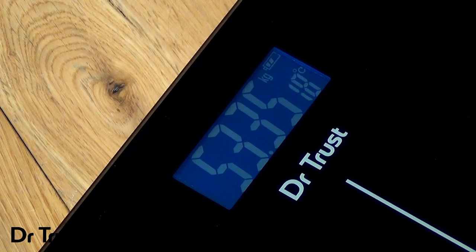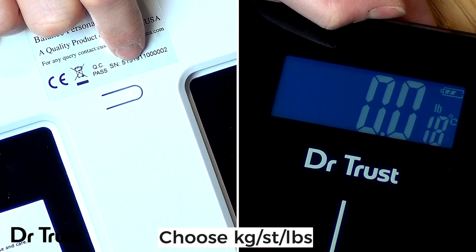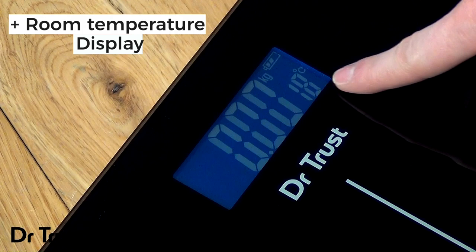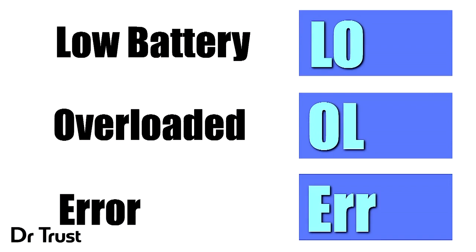You can even adjust the unit of measurement by pushing the button on the back of the scale to display your results in kilograms, pounds or stones and pounds. There's an added room temperature gauge in Celsius for your convenience and the display will indicate LO for low battery, OL if overloaded or ERR if there's an error in your reading.